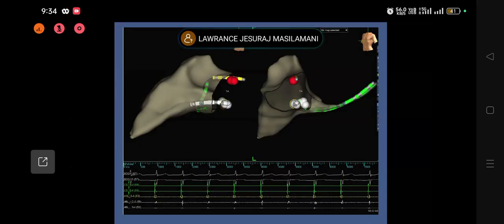When I started ablating, you could see junctions coming in. You don't want fast junctions. There are people who don't allow even junctions more than 100 beats per minute, but I usually allow at least 100 to 120 beats. But if your junctions are too fast, then you stop.